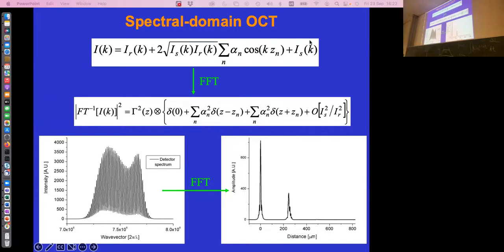Which peak? The smaller peak. This peak corresponds to the modulation frequency of the signal. This is a signal that consists of a pulse with a very strong modulation. When you do the Fourier transform, the zero component of the Fourier transform is the area under the curve. So this peak here corresponds to the area under this curve, and then this modulation pattern creates this other peak.